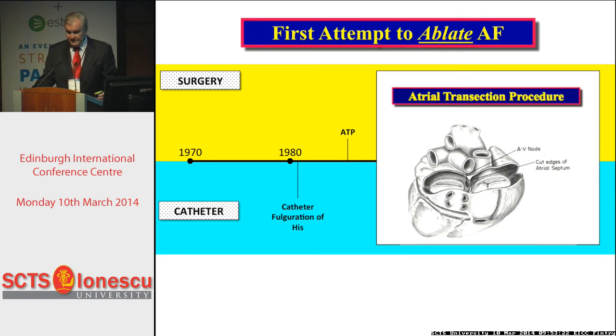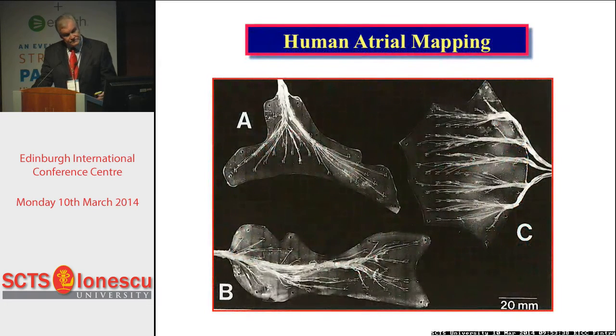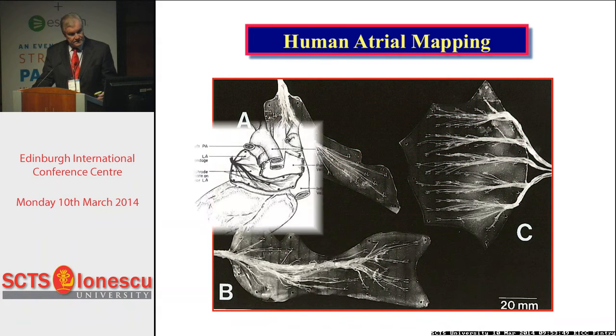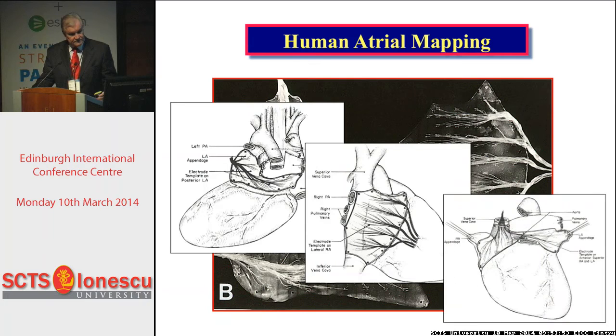So during that time, we were getting closer and closer to understanding what we thought was the basis for atrial fibrillation because of the mapping, primarily doing three-dimensional mapping in animals using 256 bipolar electrodes, and mapping patients who had the WPW syndrome but who also had atrial fibrillation, using form-fitting silastic plaques containing 156 electrodes and putting them on the surface of the heart. We subsequently developed a sponge electrode that we could map with.